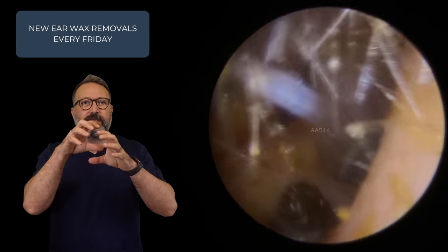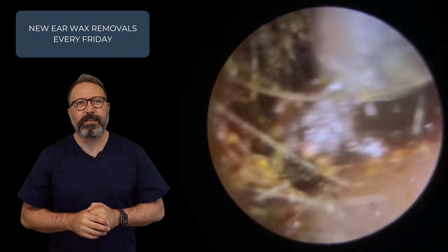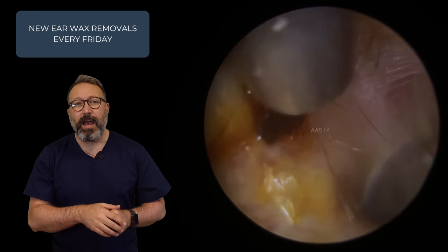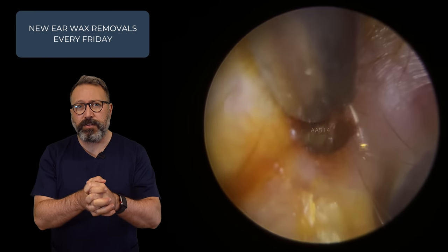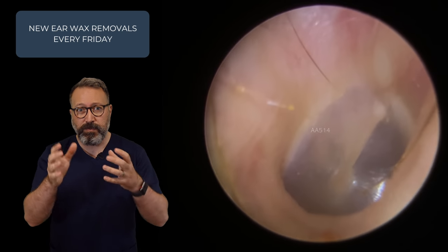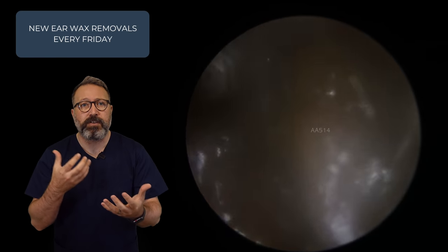We were just working on the front end — you could see it's very thin, that front end; that's just where we were holding onto it with the suction and making that circular movement, which tends to pull out and taper that front end. A few more little pieces to come away. I actually did a really, really good one today but didn't have time to edit it, so that's going to come into next week's video. We're super, super busy here, so it's easier for me to upload one long video on a Friday. You can see a good light reflex there — look at the difference, how shiny that eardrum is compared to the last one, where you're getting a really good light reflex bouncing back off the eardrum as we shine it in.